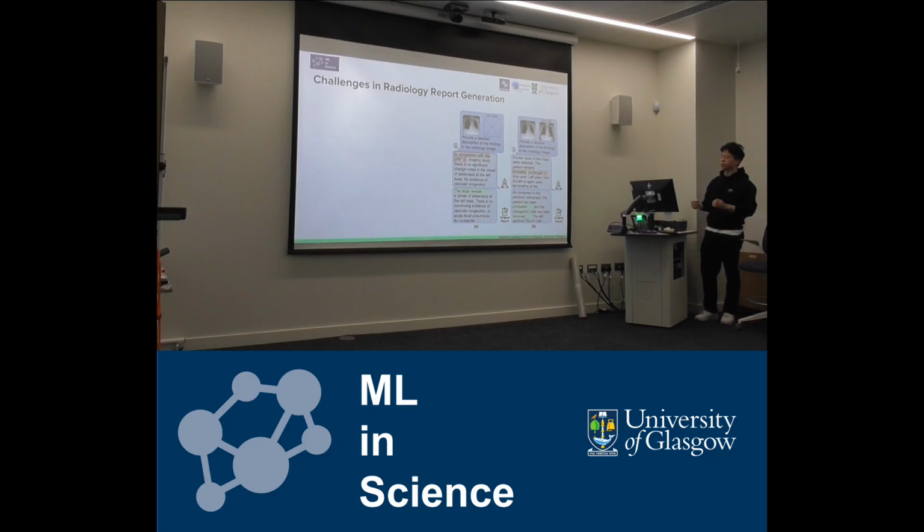Here the key issue is that most models can only look at a single image in each turn, which means they probably ignore the temporal dimension, whether the disease is getting better compared to the previous scan, or getting worse, or staying the same.